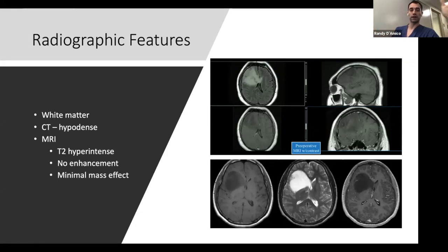So on a CT scan, the air surrounding the skull is black, pitch black, and that's the most hypodense structure. The bone itself is the most dense structure, typically anyway, and that's extremely white. And so then you can window it and play around with it. So these things would show up as hypodense because they're typically slightly edematous. They've got more fluid in them, and they don't look like normal brain. They obviously don't look like bleeding or anything like that.